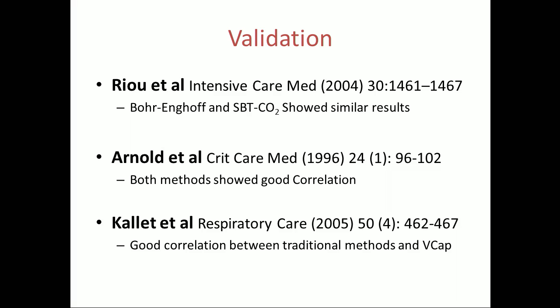There are, of course, other studies which have looked at using volumetric capnography to measure dead space. They're in slightly different clinical settings. However, by and large, everyone concurs that there is good agreement between the two methods of measuring dead space.